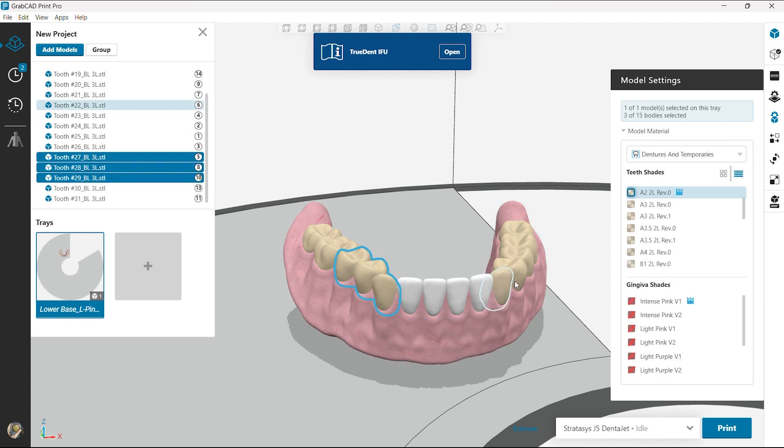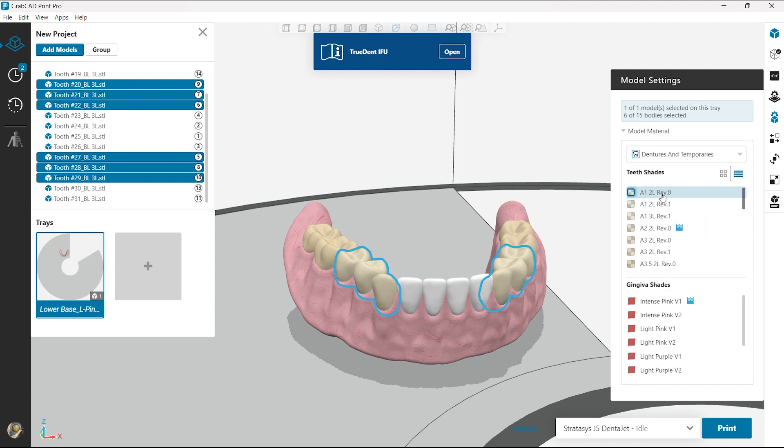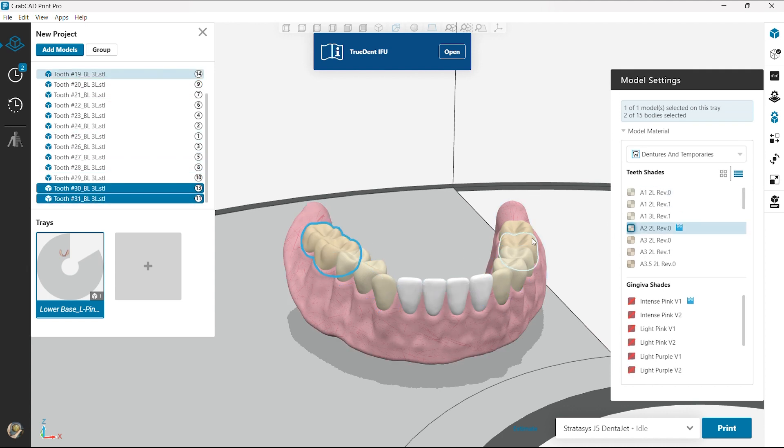To the next three, maybe an A1. Now it's good. And so here you can have each different tooth with a different option if you wanted to, so we can accurately make these dentures as aesthetically pleasing for the customer.